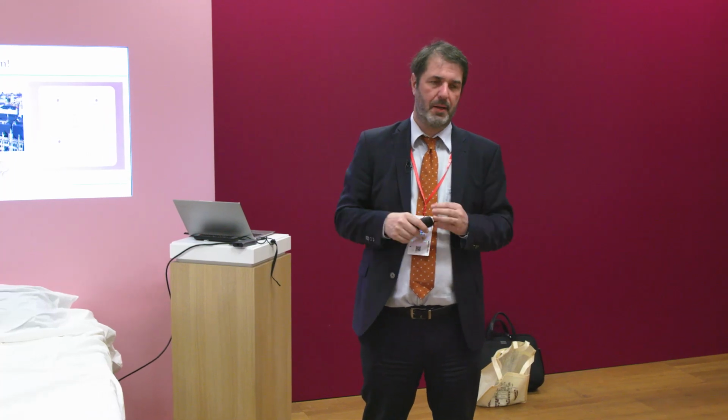What are the challenges with this kind of technology? It's not a challenge. It's an additional tool. So you combine two advantages. So it's perfect. You just have to do it. That's the only hook. You have to start, and once you have done this, it's very fast.